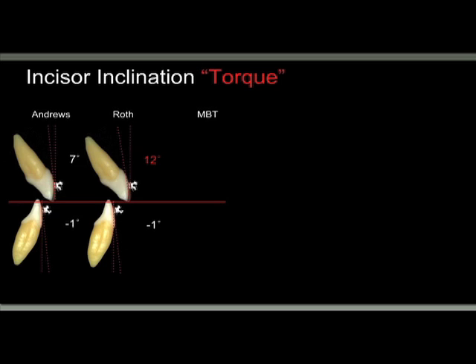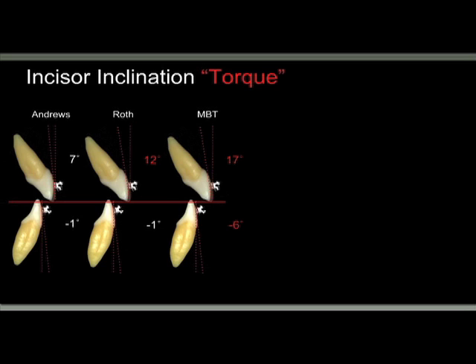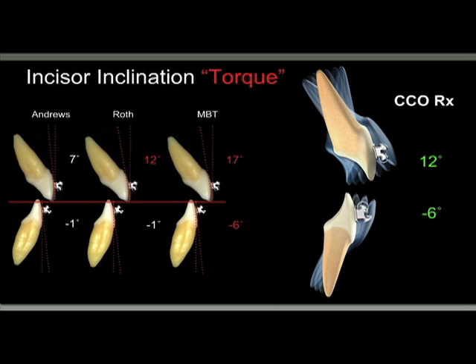And we have changed over the years from the Andrews prescription, the standard, to the Roth, where he increased the torque of the upper teeth, because it's very difficult to achieve proper torque in some of the appliances that they were using at that time. They needed to fill the slot, and losing torque was common, specifically in extraction cases. Then, as we mentioned, MBT increased the torque of the upper and increased the lingual torque of the lower incisors due to play in the arch wires, 19 by 25 stainless steel, and the brackets. And we have used them all in self-ligation.